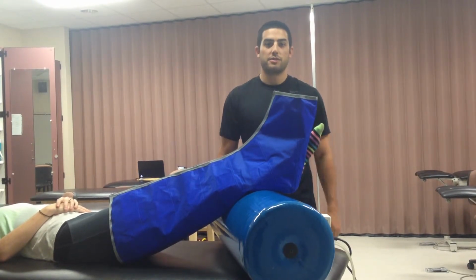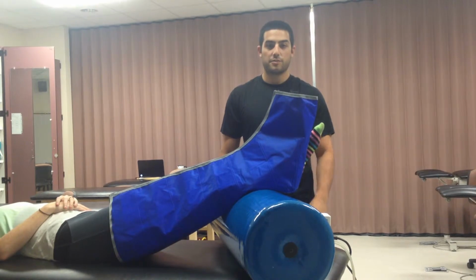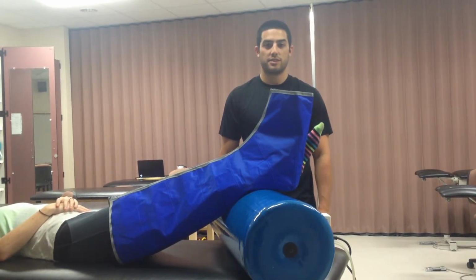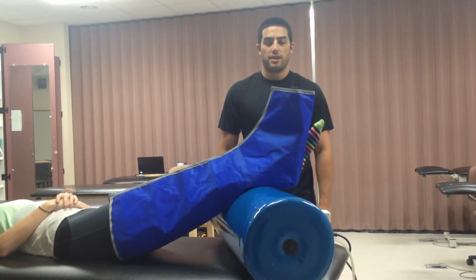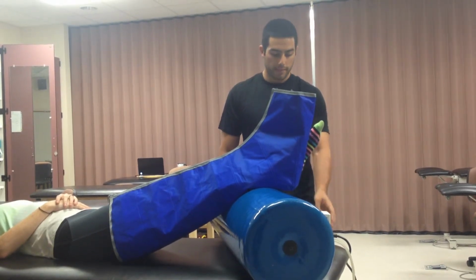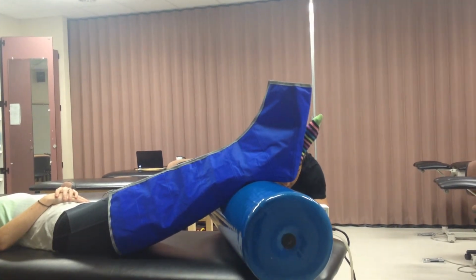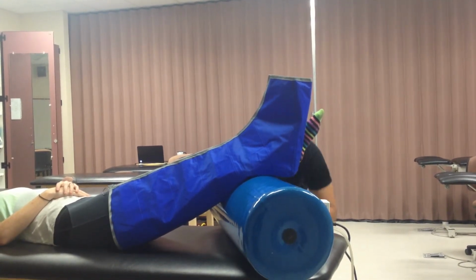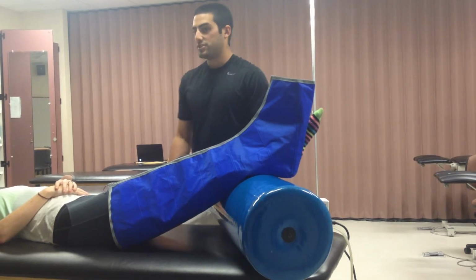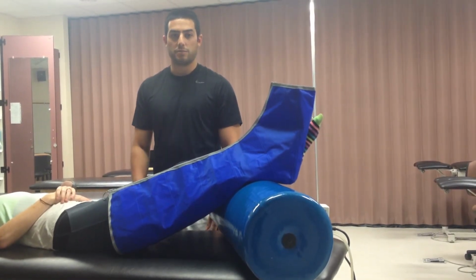The parameters for deep vein thrombosis are 75 seconds of compression and 25 seconds of non-compression at 60 millimeters of mercury for a 3-hour treatment. Once I set the parameters on the device, I will tell the patient that if there's any discomfort or she needs to notify me in any way, to please do so.